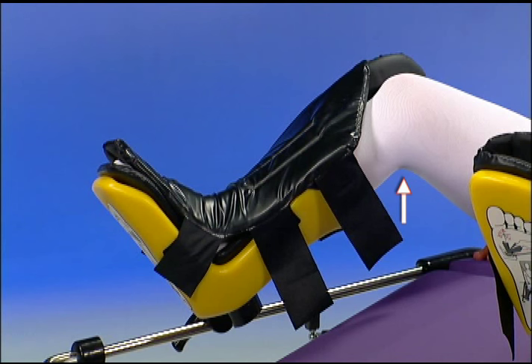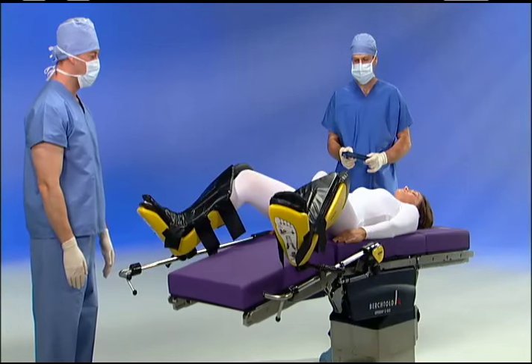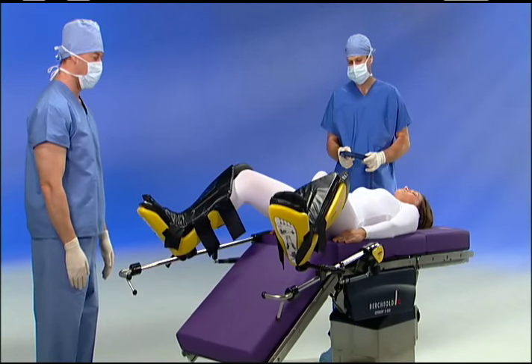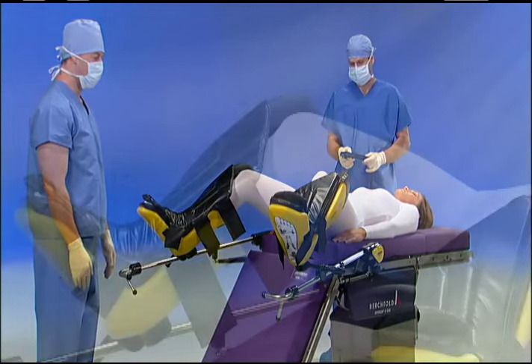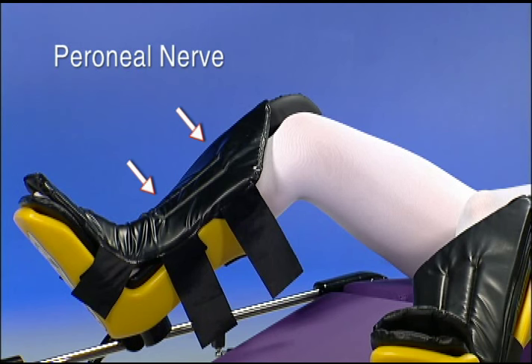Make certain there is a slight flex to the patient's legs. If using a removable split leg section, raise the stirrups a little and adjust them laterally to allow for easy removal of the accessory. Otherwise, simply lower or remove the foot section. Notice that there is no pressure under the popliteal fossa or where the peroneal nerve or saphenous nerves are superficial.